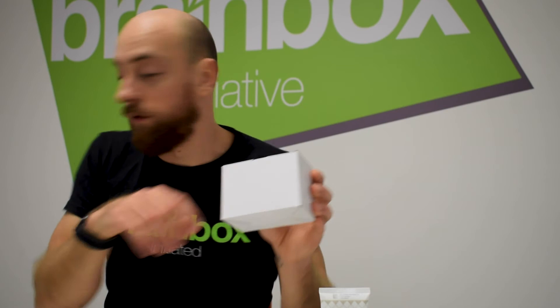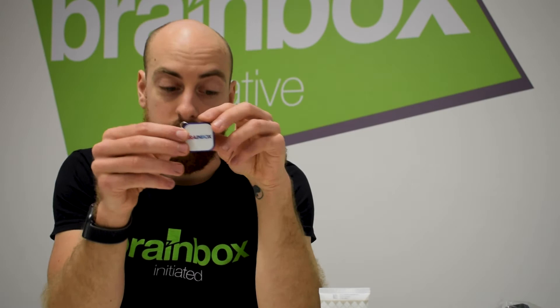Finally, we have the charging plug with additional adapters to make sure you can charge the device wherever you are in the world. The last thing in the box is the USB drive. On here we have the user manuals for the software and the hardware, and we also have the PINs needed to deliver sham or active stimulation during double-blinded studies.